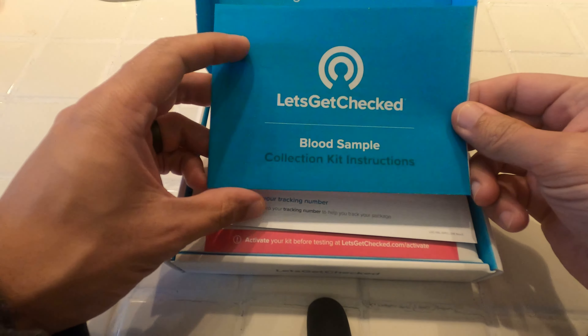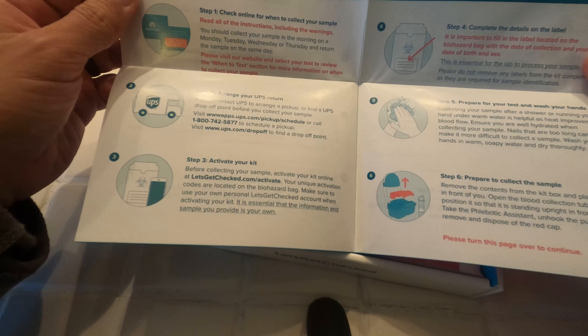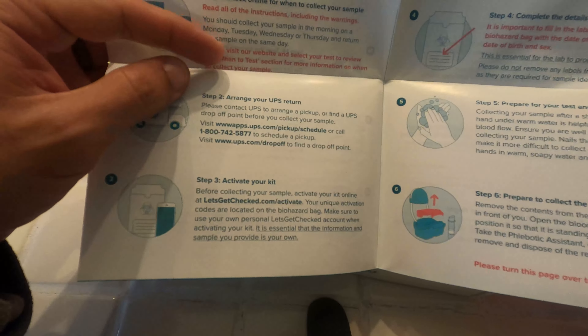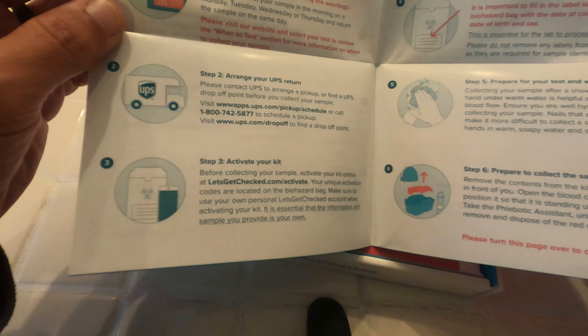Looks like they have the instructions here that go over what you have, including the blood samples. Reading the instructions is important in the beginning because you want to make sure that you don't send off your sample on a weekend due to the mail. You actually have to coordinate how to return your sample.